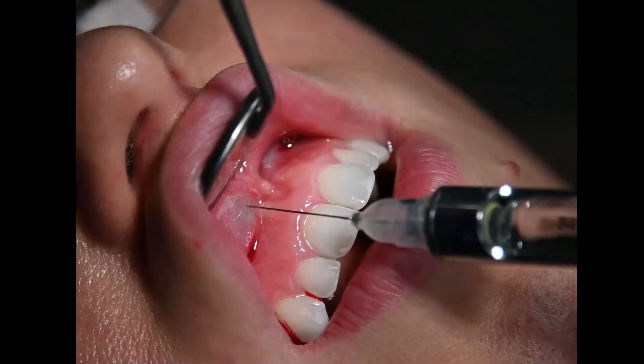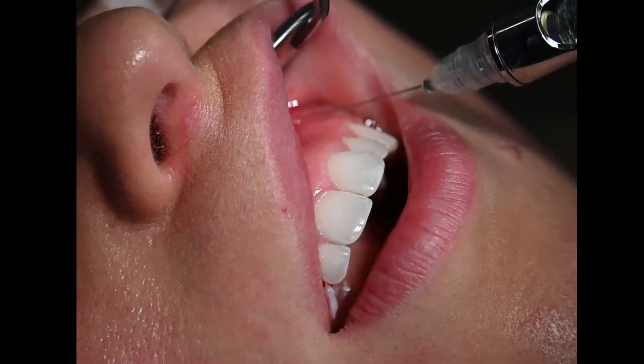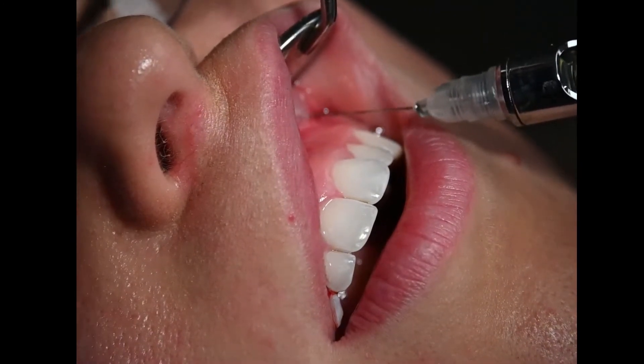As you proceed to inject in order from 9 to 11, each injection will not be felt, as the previous injection site spreads to mask the injection on the new site.